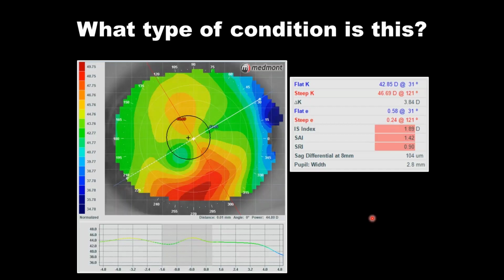And here's the topography. When we remove the contact lens, you see this patient's astigmatism and this kind of irregular inferior cornea. Is this a sign of irregularity? Is this a diseased eye? The slit lamp signs were unremarkable, and the vision was very good, 6/6 vision with the spherocylinder refraction. So it makes one question, what is this area here that we're looking at?